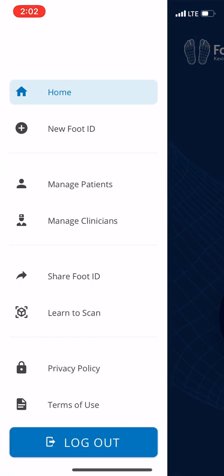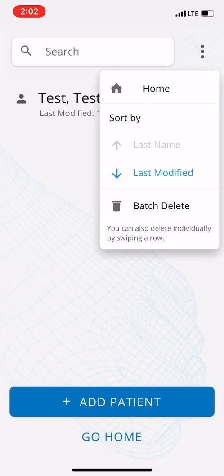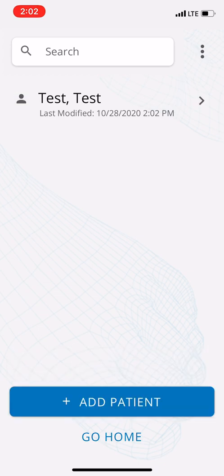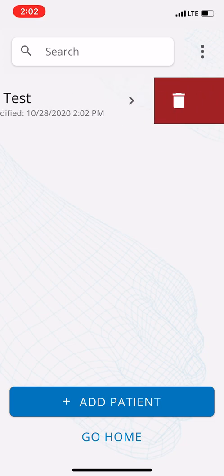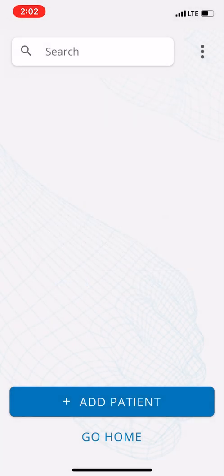There are a couple of different ways to delete patients. One is to batch delete and select all. The other way is to hold the patient entry, slide it to the left, and the red trash icon will appear. You'll get a pop-up asking: 'Are you sure? All data associated with the patient will be permanently deleted.' I'll click yes — and now we have no patients.